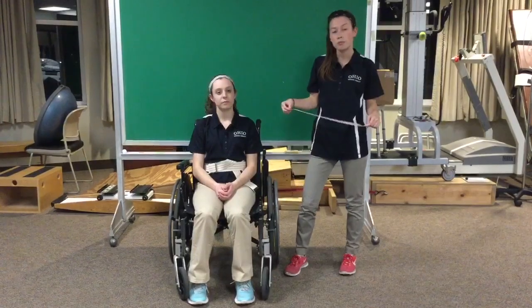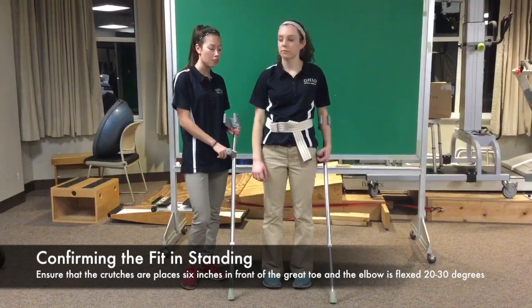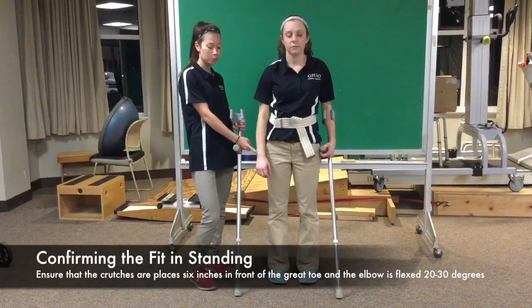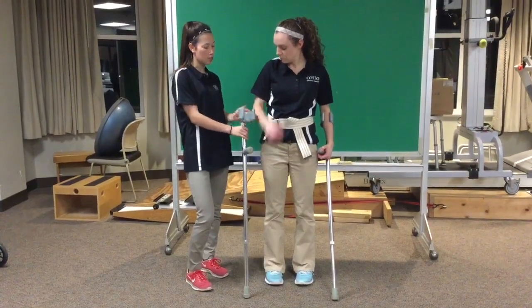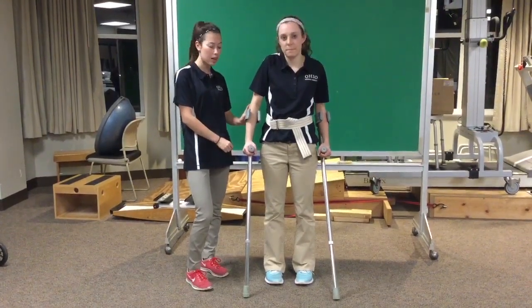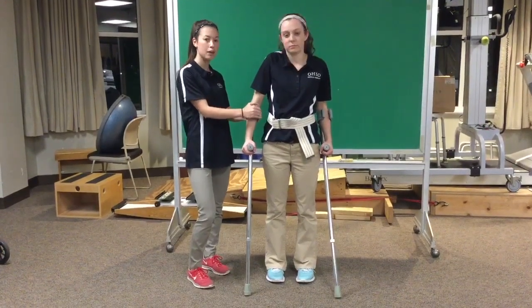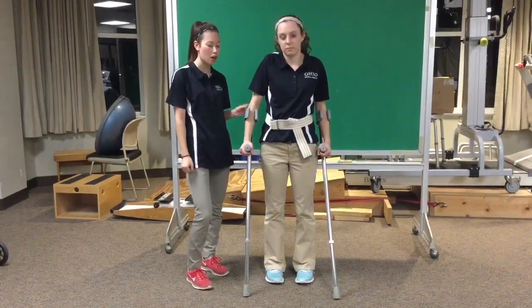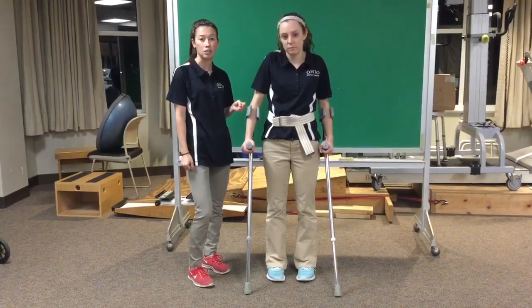The height of your crutches is going to be the sum of these two measurements. When confirming the height of the lofstrand crutches, check that the grip is at the same height as the ulnar styloid process. Also make sure that when the grip is placed on, it is an inch and a half away from the olecranon process. You can adjust the cuff to fit the forearm better by squeezing it together. You want to make sure it's tight enough that it does not fall off when you move your arm, but not so tight that it's gripping the patient's arm.